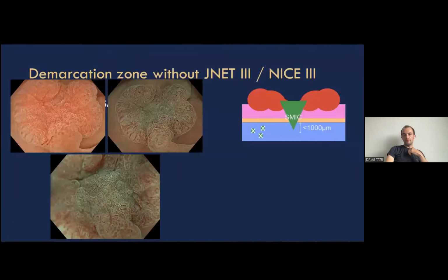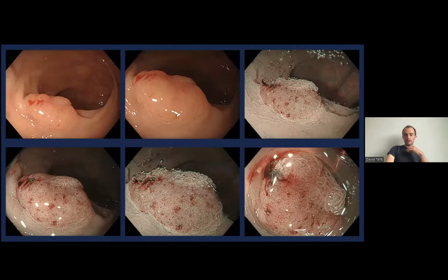Just to say, a demarcated area may not always be cancer. So you might look in that demarcated area and you might see that there is a completely regular pattern. And here you might argue that you look from afar, you clearly see a depression, often associated with a demarcated area, but that area, when you zoom in, does not contain an irregular pattern. And so indeed, this is a demarcated area, but doesn't have evidence of an irregular pattern and is therefore not a concern for cancer. Another example of that can be seen here.